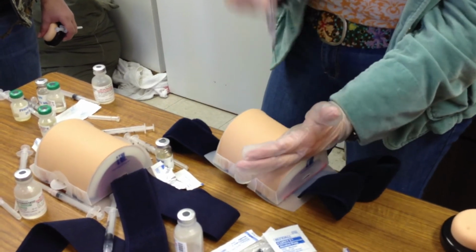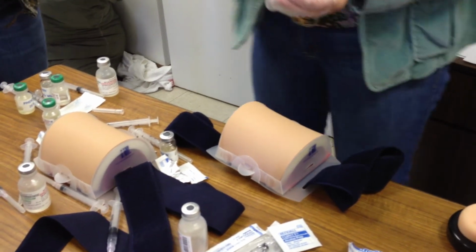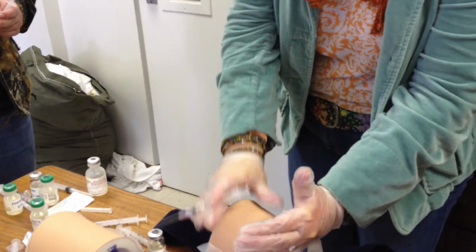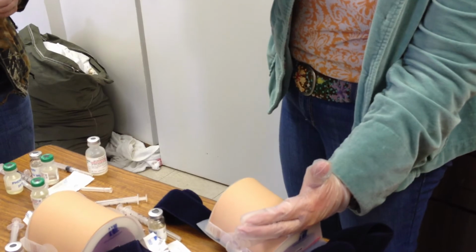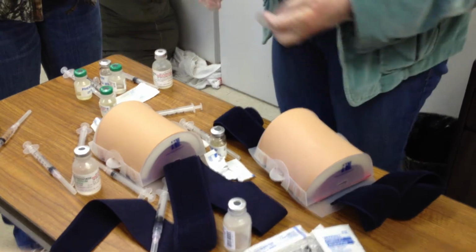Okay, but I want you to get that hand out of the way so that you're not going to poke yourself, because now you have a dirty, contaminated needle, and it's really important that you look not only for your patient's safety, but your safety as well. So you come on out, and then let go. And it's not imperative that you immediately put the alcohol pad back on your patient and clean it off. It's really not. So take your time to be safe and scoop recap the needle.